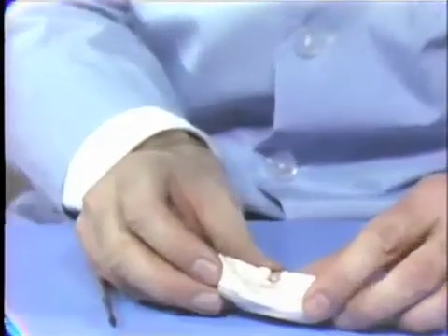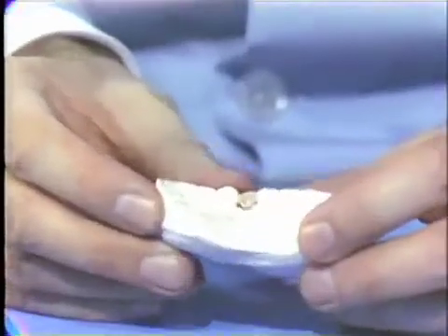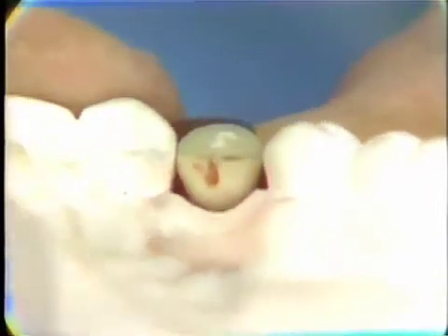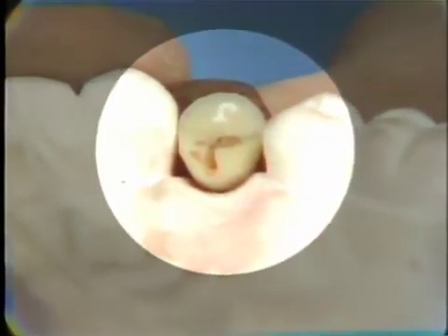I think if we can close in on that, you can probably see now that we've got a better contour there in relation to the tissue. The two are more or less concentric circles. Perhaps create just a little more space on the mesial there. You can see it's a little more open next to the cuspid, I should say.